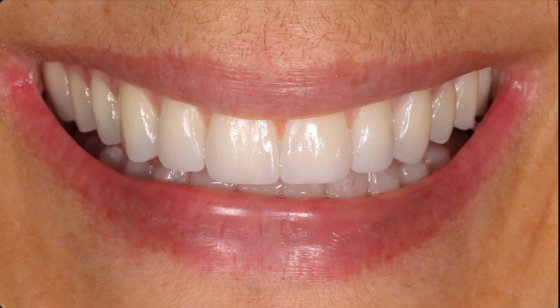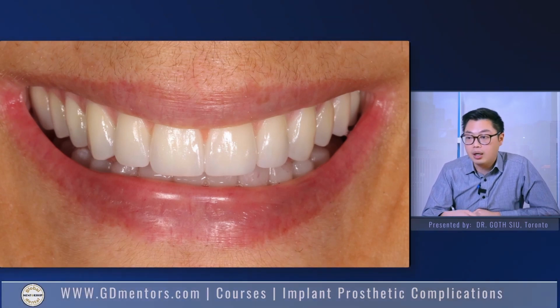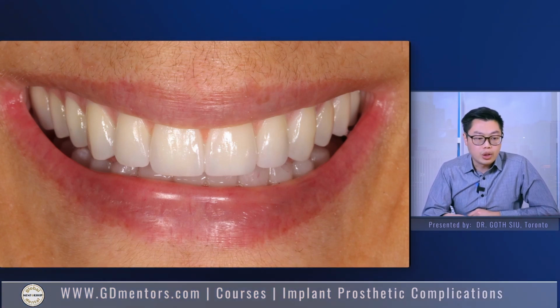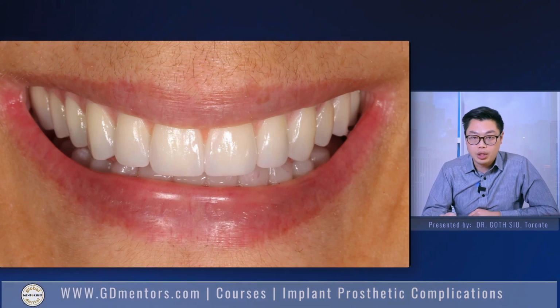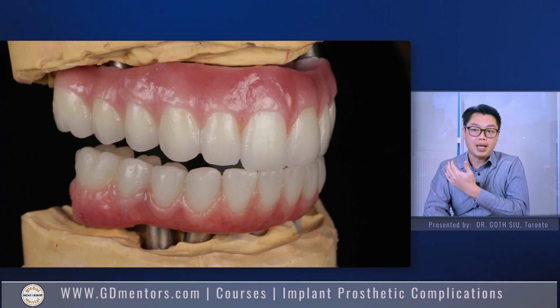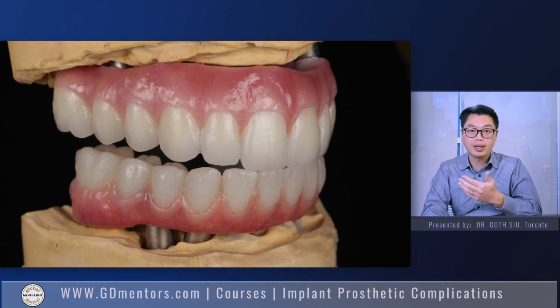Now, it's easy to show before and after, but I can tell you, I spent many appointments for this patient to a point where it's literally financially not even worth it, right? Because there's a lot of things you gotta look into that you're trying to balance, right? Especially on a patient that's very non-adaptive. The implants are in, so we can't change the implant position. So we're now trying to connect implants to teeth, and we're trying to position teeth to make things okay for the patient, and we're trying to juggle all these things.